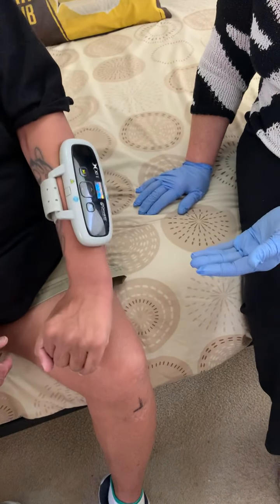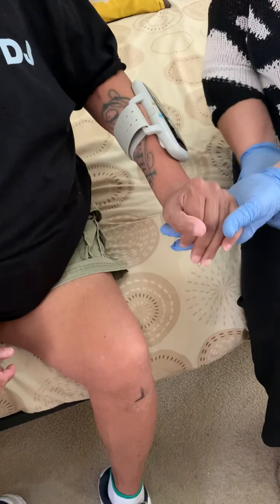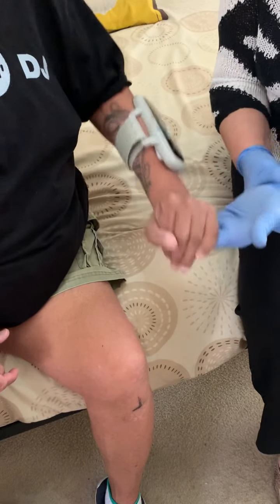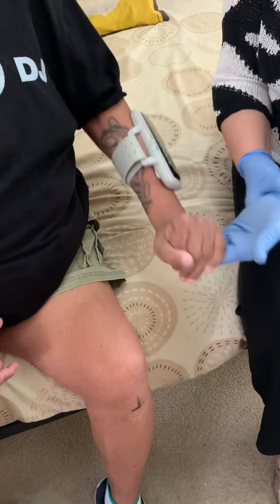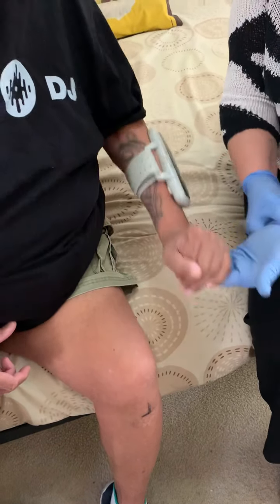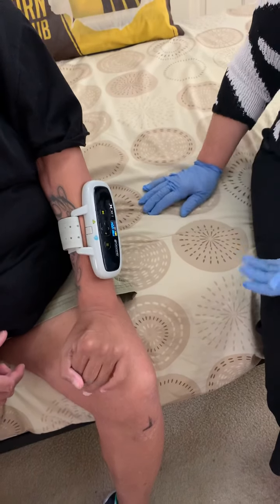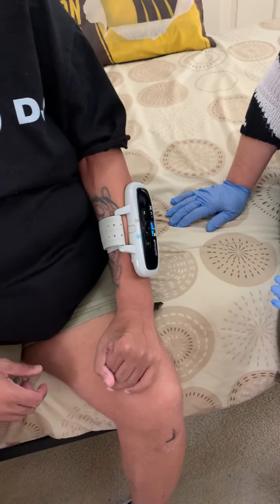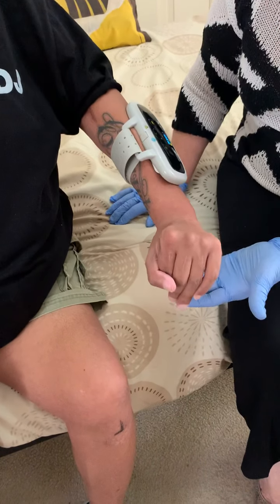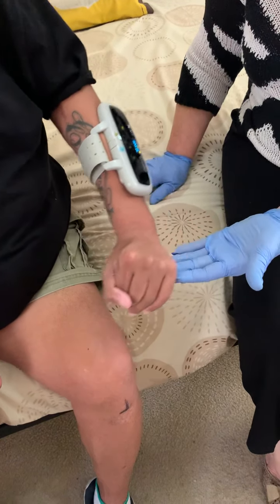And what if I show resistance — can you still shake it? We'll give it a go. So now you've got a bit of resistance. You're pushing it really hard. I'm not moving. Come back and relax. Lifting my hand up now again to bring it to my carer and open. I didn't relax my shoulder that time.